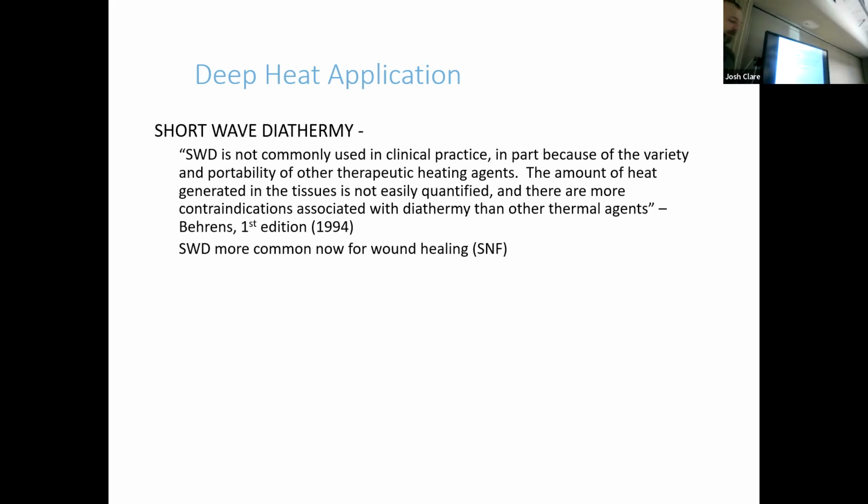And then I called up this one woman, Meg Horton, wonderful lady. She runs the rehab department at the Coventry Respiratory and Rehab Center, owned by Genesis. I might be messing up that name. Anyway, talked to her and she says, oh yeah, we use it all the time. I said, wait, what? It's not the answer I wanted to hear. She said, yeah, we use it for wounds. We get docs sending patients only to us because we heal wounds faster and better than anyone else can, and one of the reasons is because we use this diathermy. I go, oh, that complicates things for me.